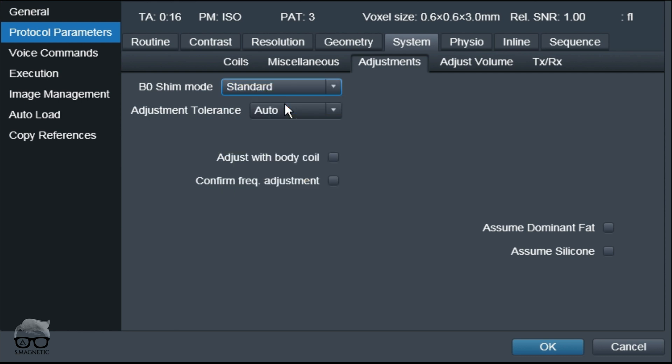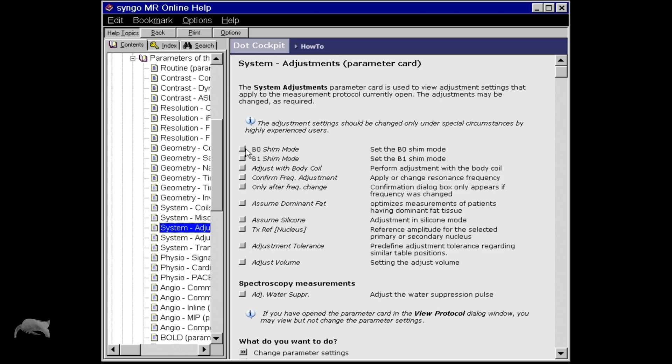So I changed it to "Standard", as you can see here, and then I did a rerun of the sequence — and voilà, the Dixon swap was gone. So this is something you can try if you get the Dixon swap.